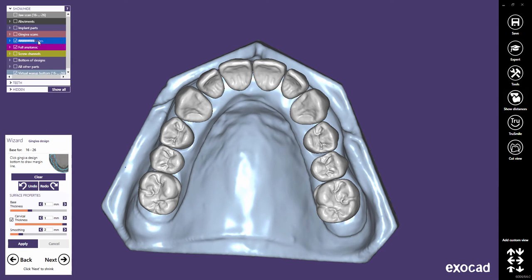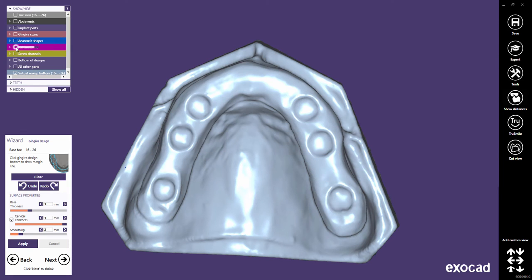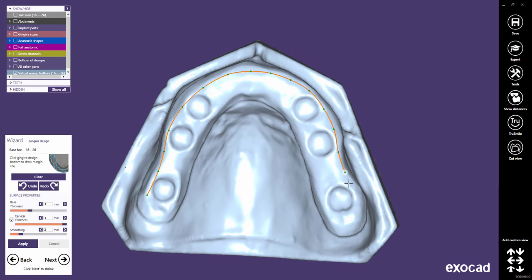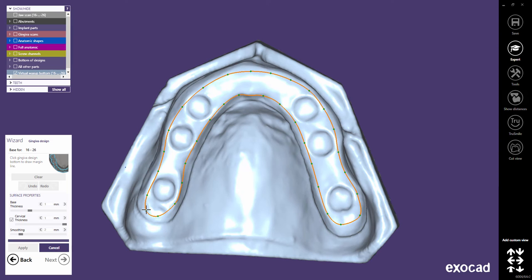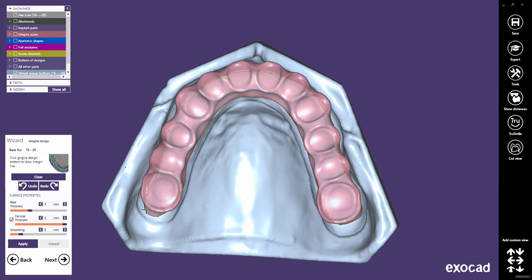For these wrap-around implant bridges, I recommend to hide the anatomical teeth in order to design a smaller gingiva area than you would normally do, as we just use it to design the major connector of the implant bridge and not really to design a gingiva. To achieve this, draw the margin line a little bit wider than the final restoration's major connector will look like.